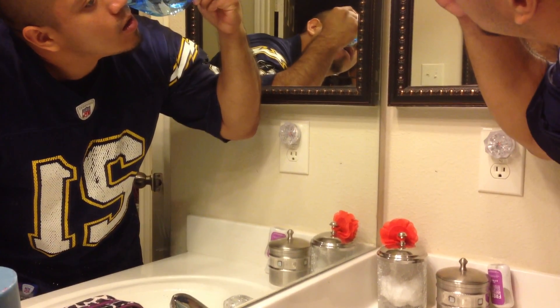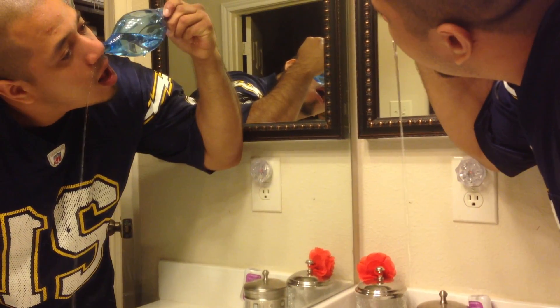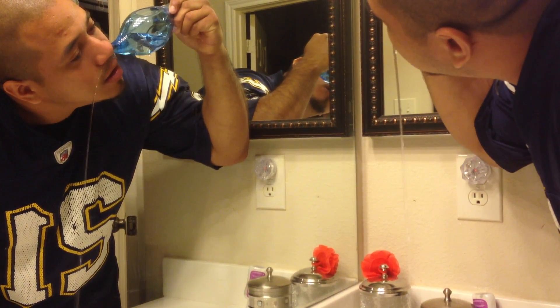Pour it. Don't turn your head, just turn the pot. How does it feel? Like a bunch of water drowning.